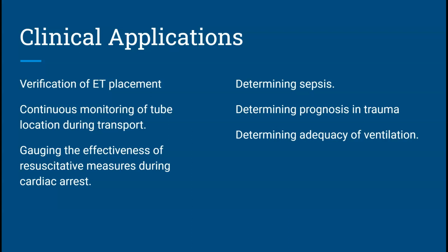Okay, there might be something, right? The patient might need to be suctioned. And all of that stuff right here is what that end tidal capnography number and the waveform is going to tell you. That's why we don't rely solely on the number of the end tidal, we use the graph as well because it gives us a lot of information.